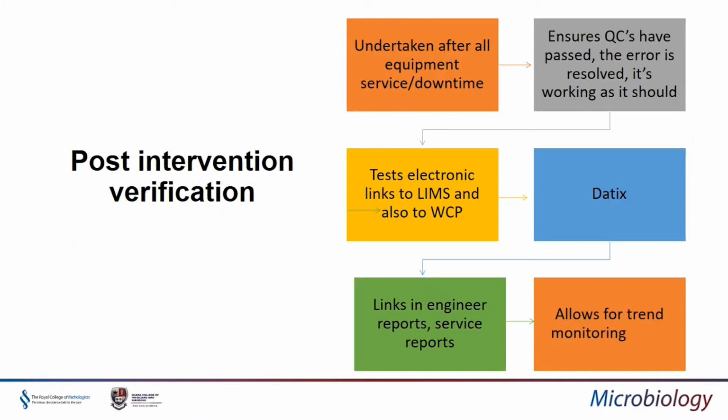So post-intervention verification. This is something that we do in Public Health Wales for any intervention that we've had for any equipment. So if any equipment is down, if anything is serviced, if anything is repaired, we will do post-intervention verification. So we have a set spreadsheet for all of the different equipment that we have. Obviously, this is just based on the Cepheid ones that we have in Swansea. And we ensure all the controls have passed, the errors have resolved, and the instrument's actually working as it should be.